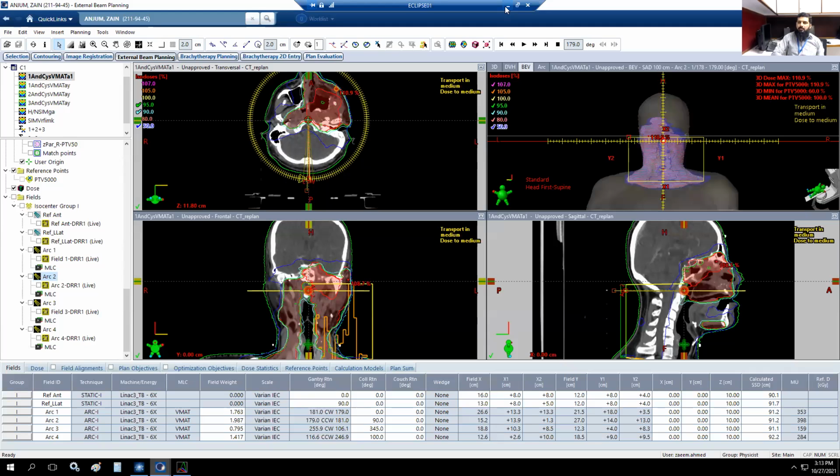Yes, we have performed end-to-end testing for the AKUH, and as I have shown, we are doing the PDIP for the patients. Relying on portal dosimetry is another challenge, because it is given by the vendor. I agree with you. But right now we have only portal dosimetry options for verification. Hopefully we will have another tool for that verification.